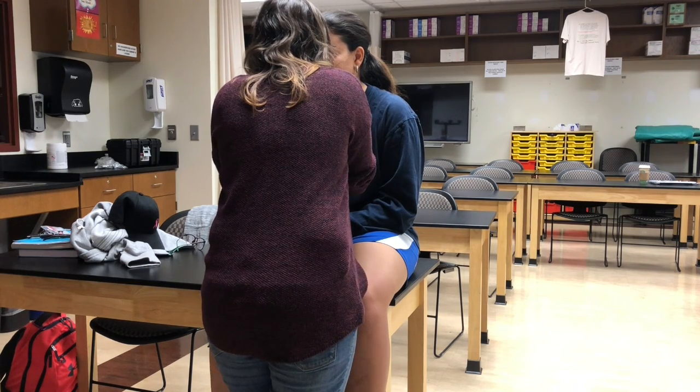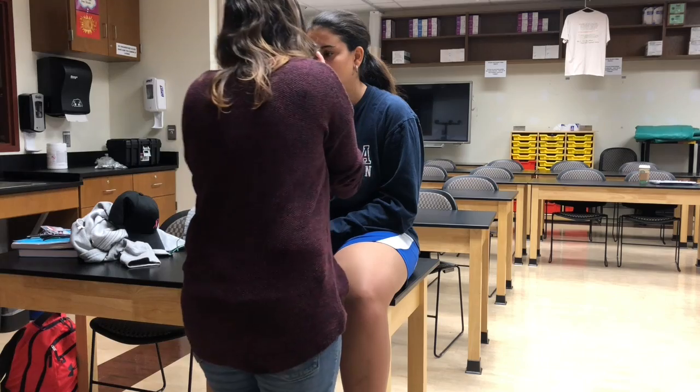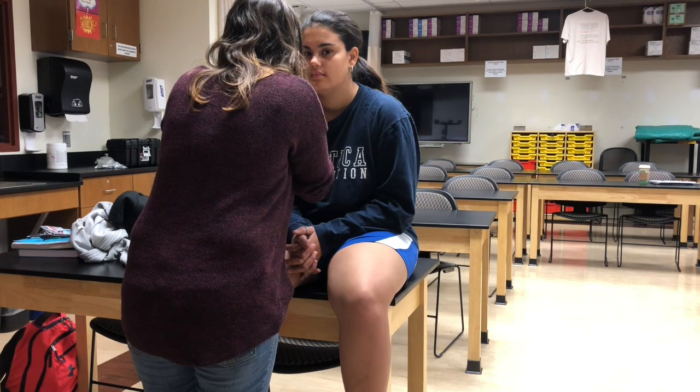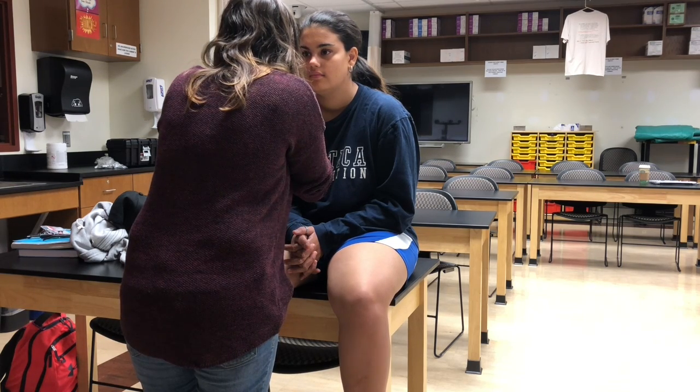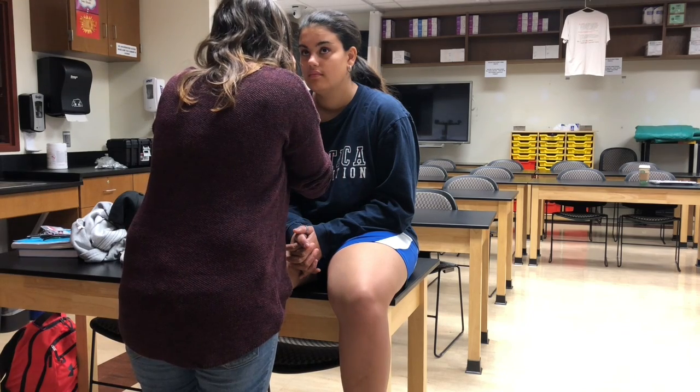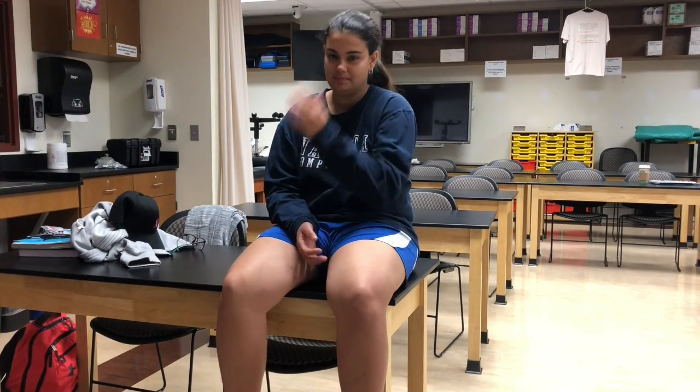On the right, hold the ophthalmoscope in the right hand and look into the patient's right eye. Place your left hand on the patient's head and the thumb on their eyelid. Hold the scope about six inches from the eye and 15 degrees to the right of the patient. Find the red reflex. Zoom in closer until you see the optic nerve, and rotate the ophthalmoscope lens until you see the optic nerve and focus in.